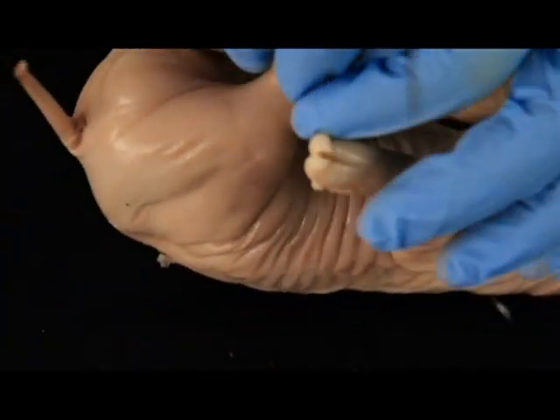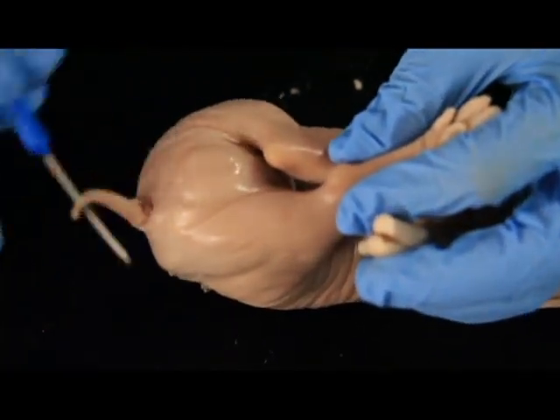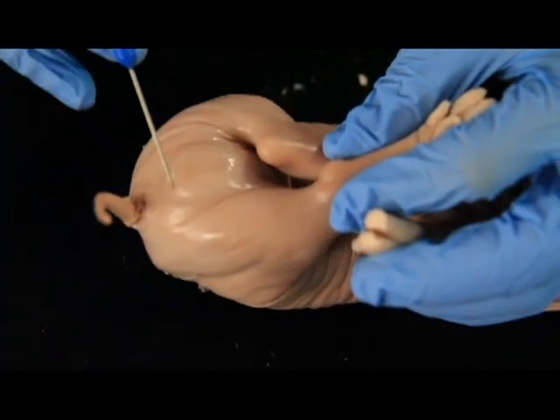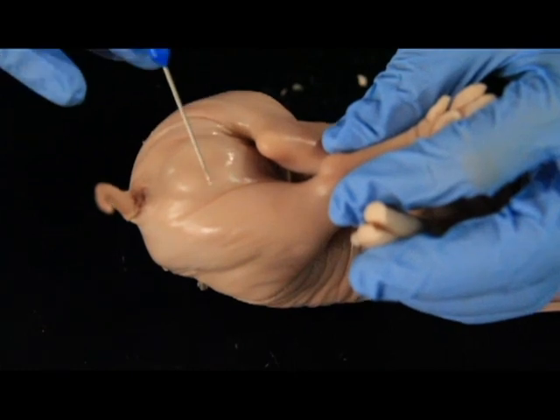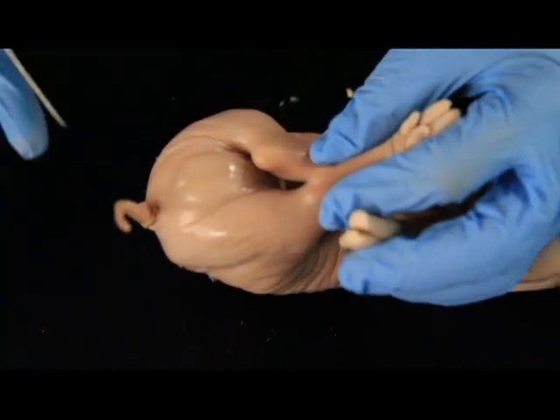So another way to confirm this is if we look back here towards the anus, you can see this bump, and this bump is very distinct, two little bumps right here. This whole part right here, this is his scrotum. Inside are his scrotal sacs, but this area right here is known as the scrotum. Again, another indicator that it's a male.